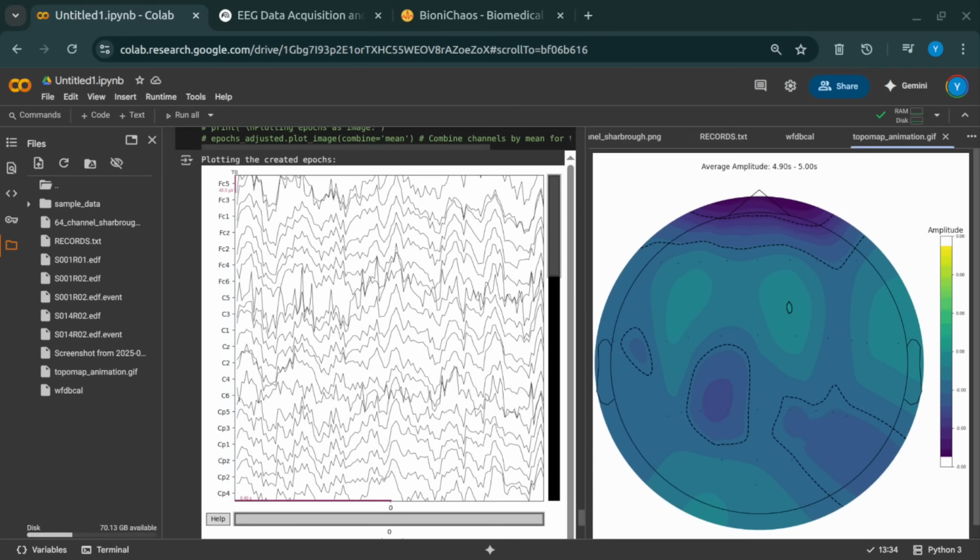Oh no, after all that channel work. Exactly. It was a real head scratcher. Like, what does T0 even mean here, and why is there no data around it? So what did you do? Dig deeper? We had to.